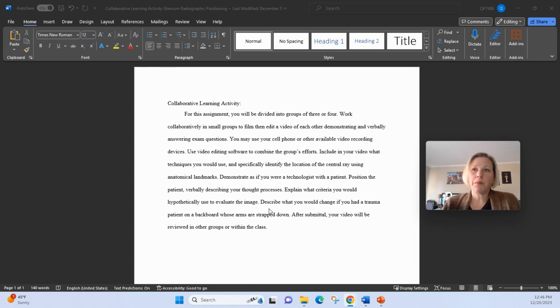So key things to remember: make sure you talk your classmates through everything, talk to your patients, inform them of what's going on, let everyone else know what you're doing, what your thought process is. Make sure you identify your anatomical landmarks, your central ray, how much you would collimate, what technique you would use, and don't forget to include your evaluation criteria, hypothetically, what you would be looking for on your image to ensure that it is a diagnostic image.